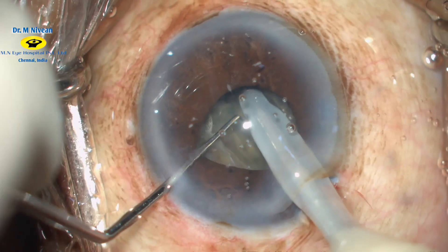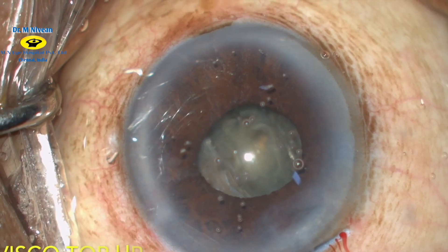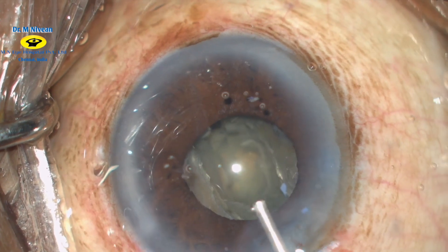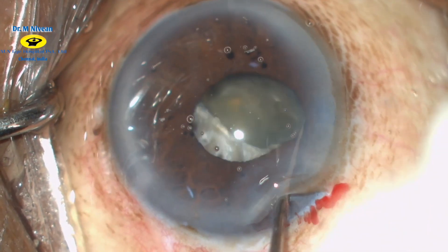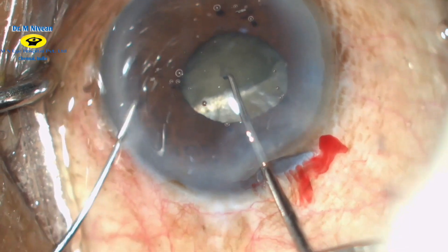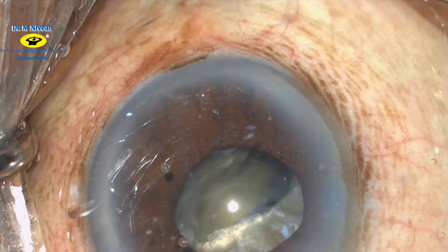The two halves are separated. In cases of hard mature cataracts, it is of importance to use a sufficient amount of viscoelastic device to protect the corneal endothelium. The nucleus is then gently rotated using a dialer and a chopper, and the other side is also split. Now we have two halves of the nucleus.